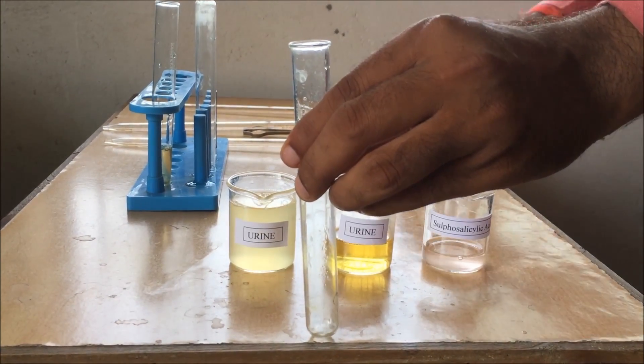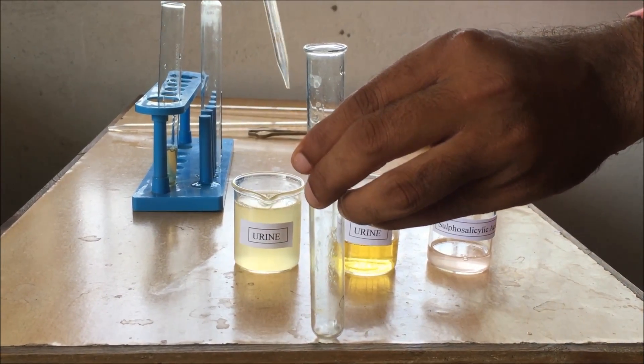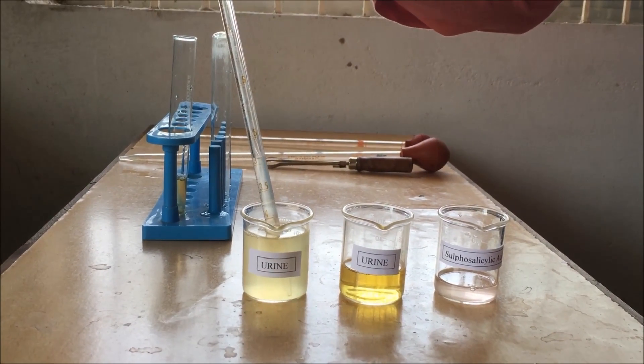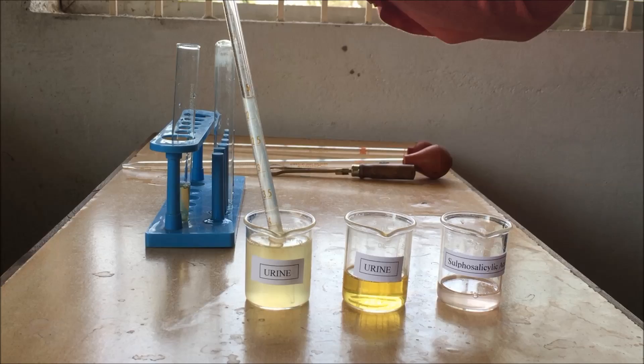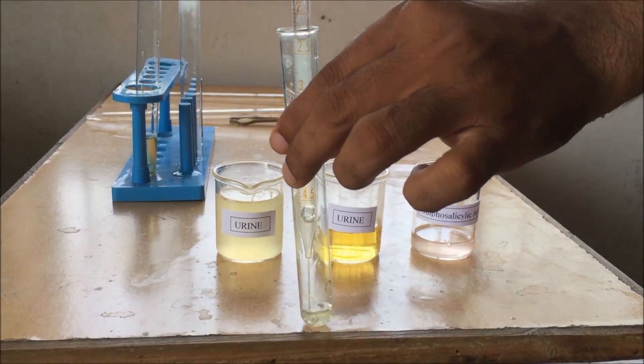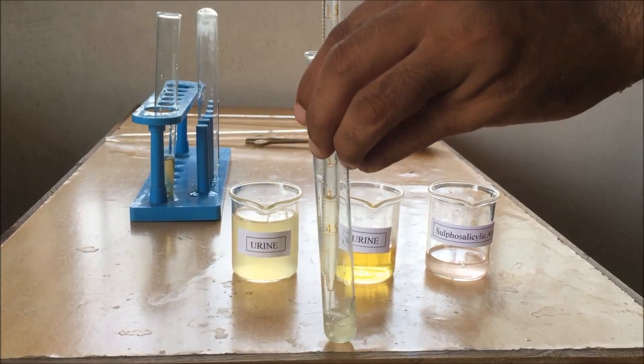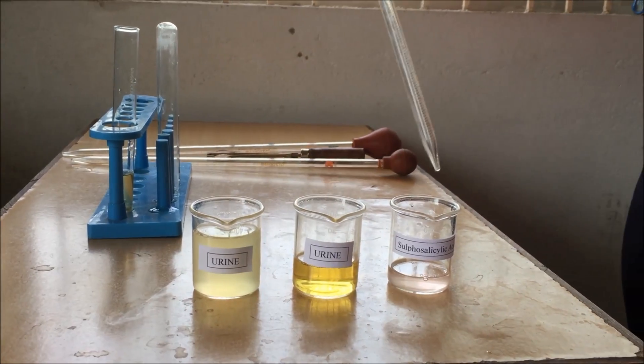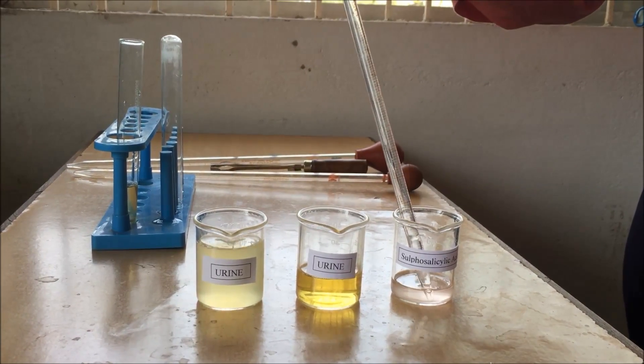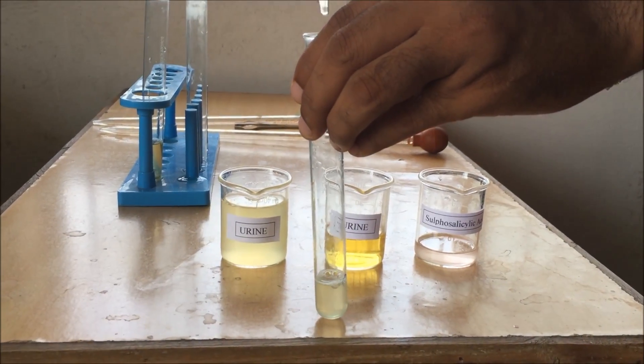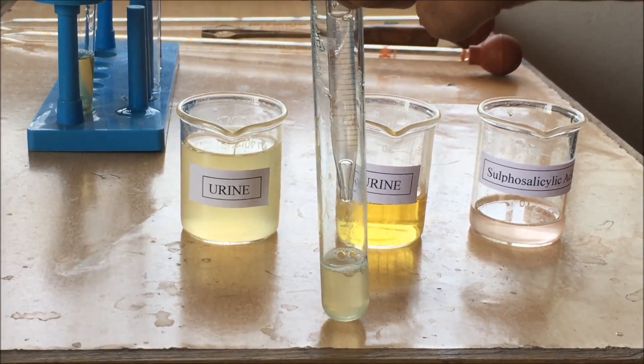Now again, we take a test tube and transfer a small quantity of the urine mixture. It is a mixture of egg albumin, urine, and water. This is a dummy of urine just to explain what will happen if there is albumin in urine. The process is the same. After transferring the dummy mixture of urine, add sulfosalicylic acid dropwise over this sample.